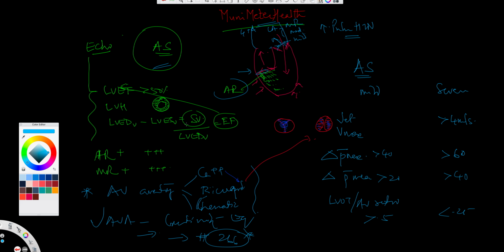in these patients, because this is what is required of you to really understand and actually quantitate the aortic stenosis, because now non-interventionally, echo is the gold standard to evaluate the aortic stenosis, and your surgeon, whoever you're referring to, will rely on your data that you're going to be referring over to. Now, on the board's exam, obviously they'll be asking you a great deal about what the ejection fraction normally should be before you send the person for surgery. Obviously, ejection fraction should be good. If it is too low, then those valves will not perform too well postoperatively or even intraoperative. So that's one of the things that you have to remember.